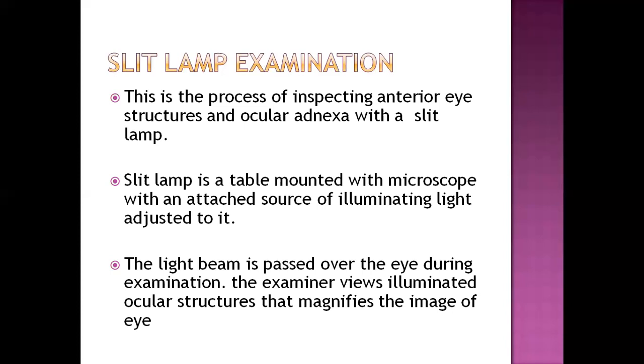The examiner views the illuminated ocular structure, that is lighted ocular structure, that magnifies the image of the eye and shows each and every part of the eye correctly. Diagram of slit lamp I will place at the last of investigation procedure video. Diagram of every test I will place at the last, that is in part 2 video. And I will again, as a revision, explain a little about every procedure. For now, this is a description only.